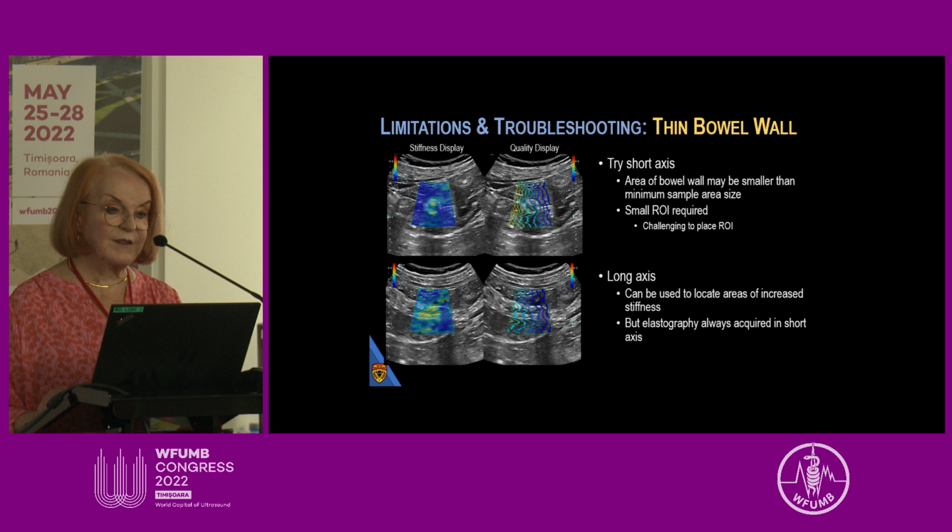And then here, this is a better example if they had included a picture of the thin bowel, but you can see in the center on the axial view at the top and the long axis at the bottom that they're looking at very, very minimal bowel wall thickening. So this is a stricture, but it does not have bulk to it. And so, of course, here again, they're encompassing far too much. And so thin bowel, in general terms, is not good, and hyperperistaltic bowel is not good.